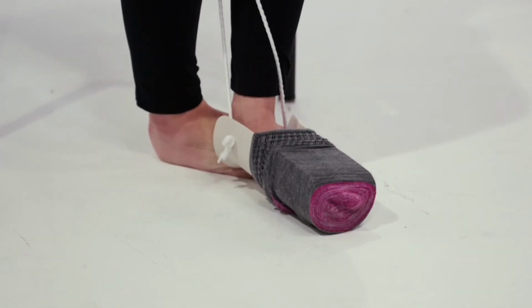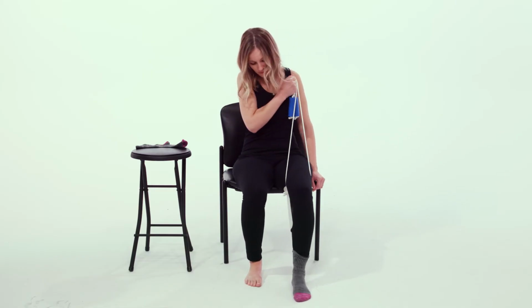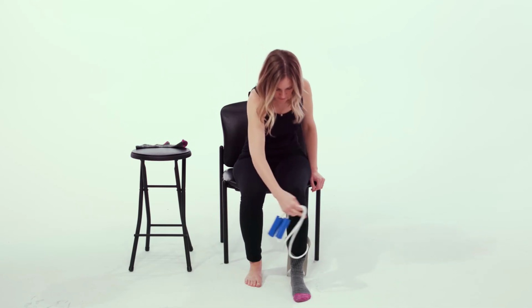Now, pull up on the rope until your sock is released from the device. Adjust your sock as needed.